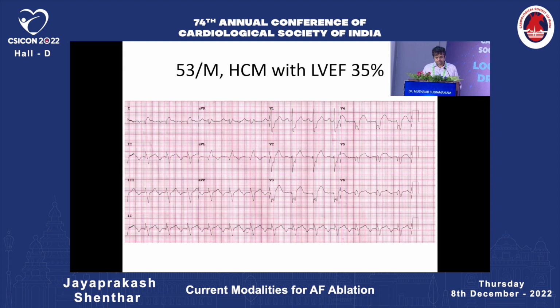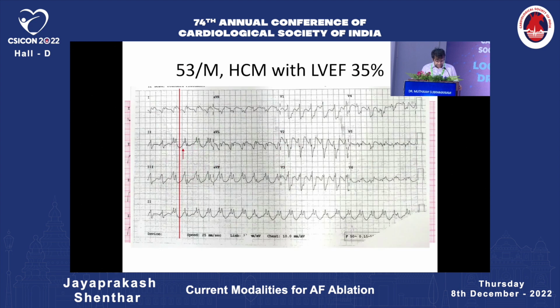So a 53-year-old male, with end stage or burnt out HCM with LV dysfunction. A wide fractionated QRS, wide QRS complexes. So this man had a ventricular tachycardia. So what do we immediately see with the ECG with regards to the ventricular tachycardia?